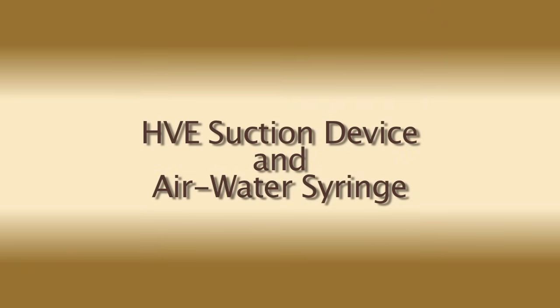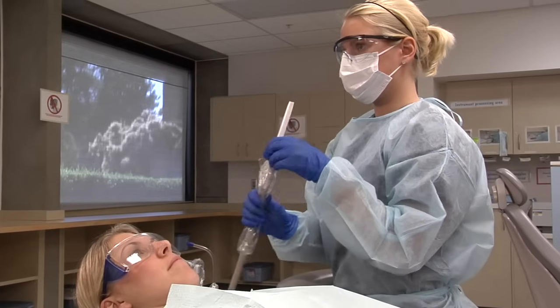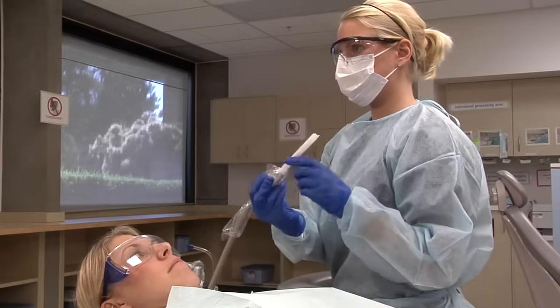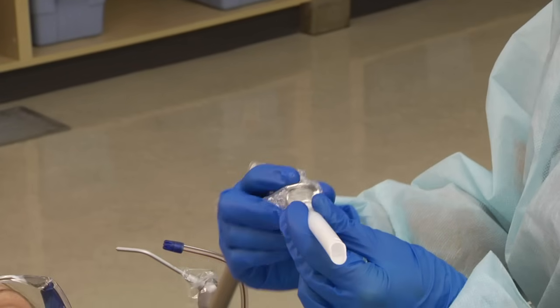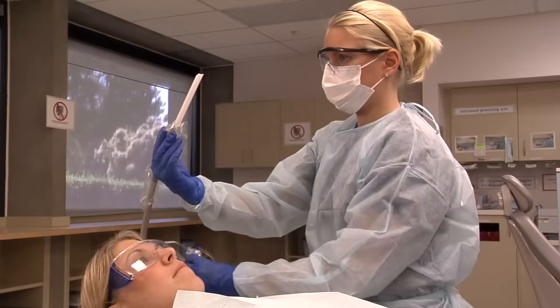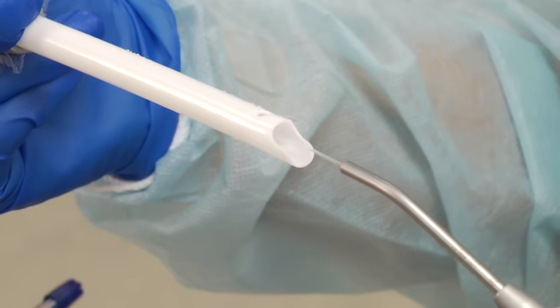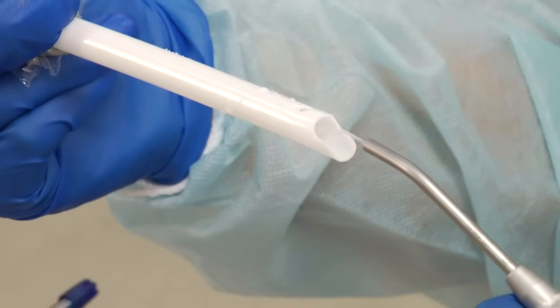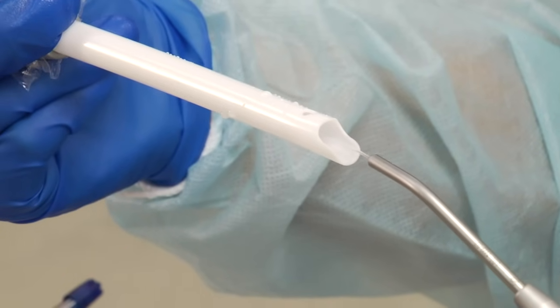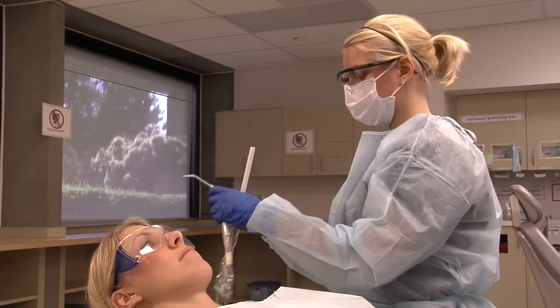The assistant can now be seated and pick up the HVE suction device in the right hand, holding it in a pen grasp or a thumb to nose grasp, and turn the switch to the on position with the right index finger. The air water syringe should be picked up and held in the left hand. With the suction device turned on, a 20-second flush of water from the syringe should be directed into the HVE suction tip. In addition, the assistant should practice an air water spray into the HVE suction tip.